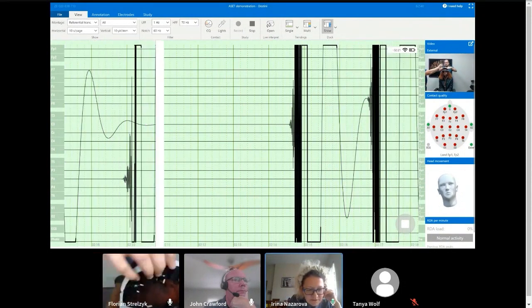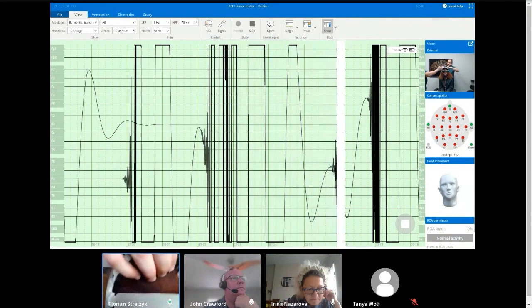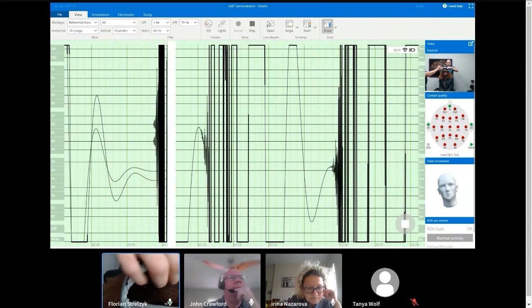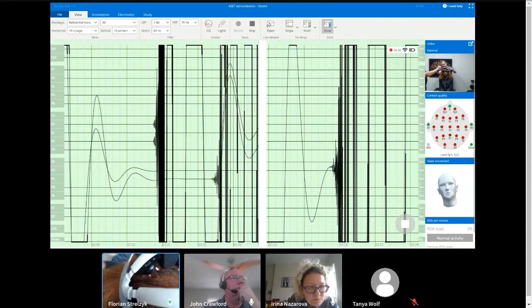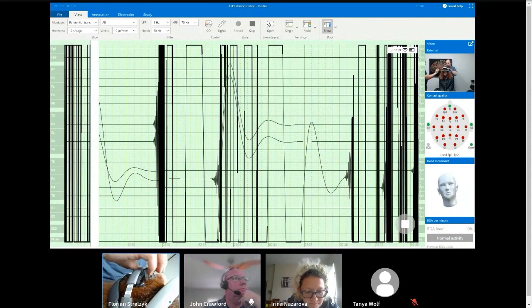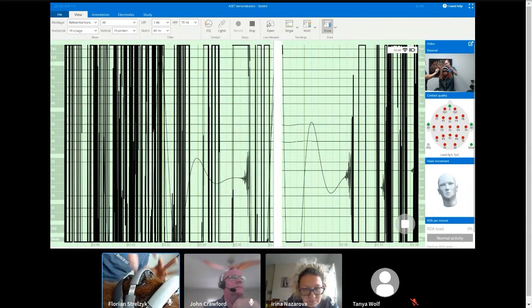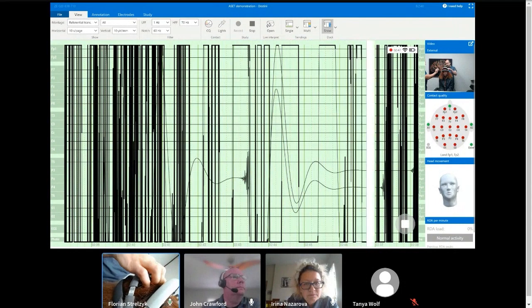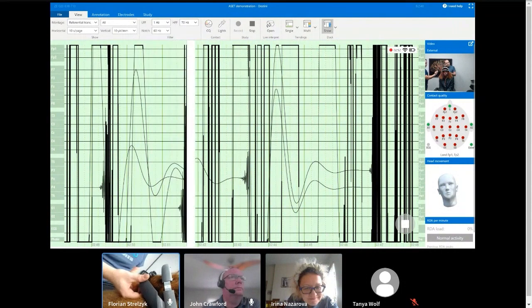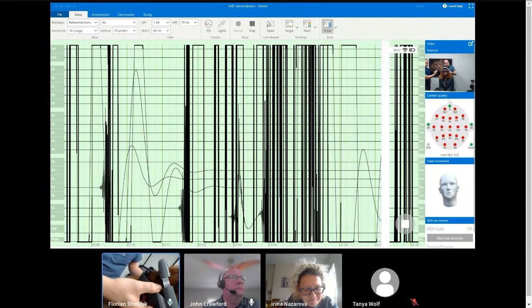Thank you for showing this. Now, what you don't see as well right now is that it's pretty springy hair. I think you'd be struggling with the traditional electrode a little bit more to keep it down, especially in the back. If you're starting at the P band, the hair starts to become very springy. But since we can apply a downward force a little bit through the headband, we actually can get through the hair quite nicely. So I think my most challenging part with this volunteer is going to be the back. But let's see.